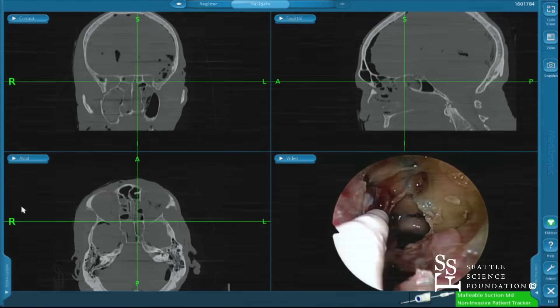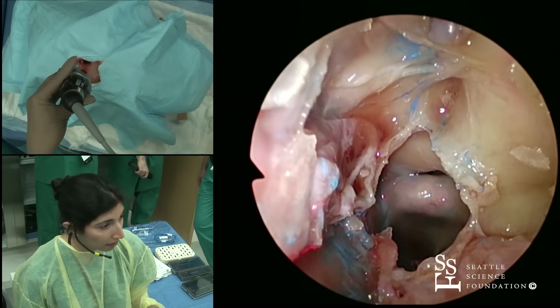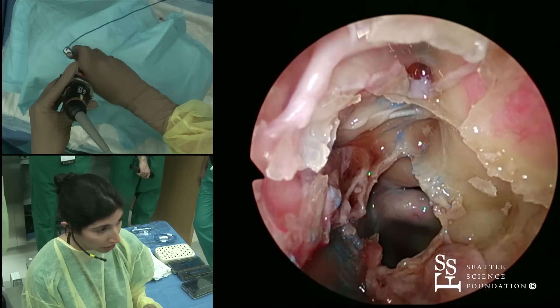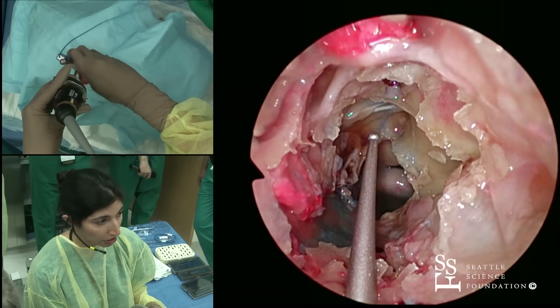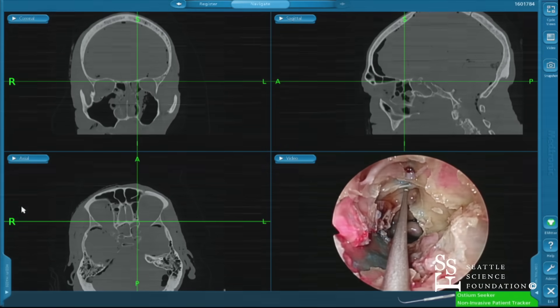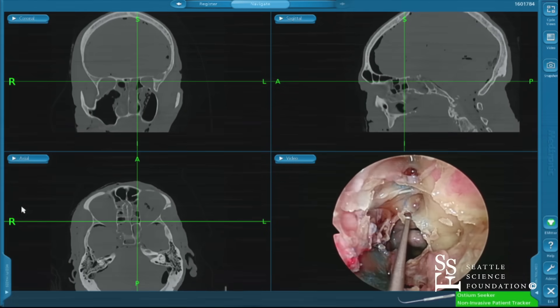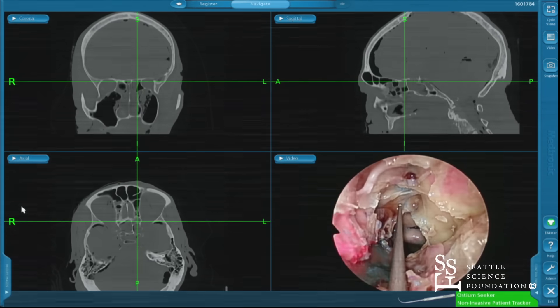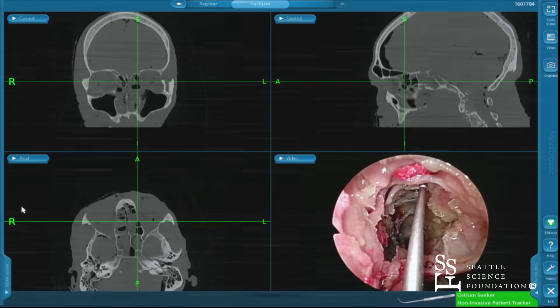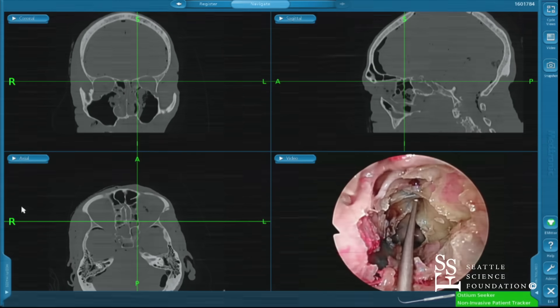I think that's probably enough for the sphenoid. I'll just move on to frontal. Now I'm going to go ahead and come up the skull base, which Andy has already gotten out for me a little bit. I'm going to switch to my frontal navigation probe so you guys can follow this. As you march forward, this is a really good way — you've got your skull base out in your sphenoid sinus, you can follow it forward and really know all the way moving forward where you are. At this point, the ethmoid cells are sort of coming down towards me, and I can't see beyond them as well because I'm using a zero-degree scope. Right around here is where I'll switch to a 30-degree scope.